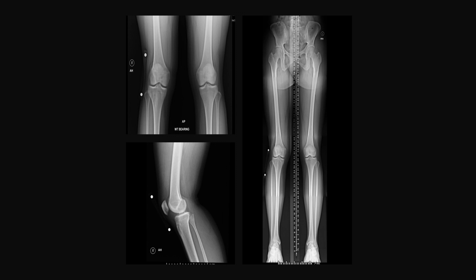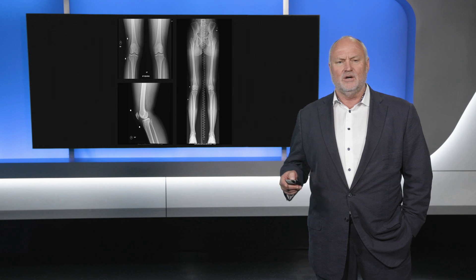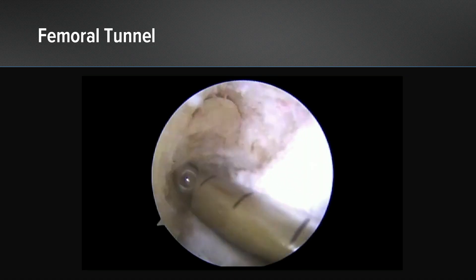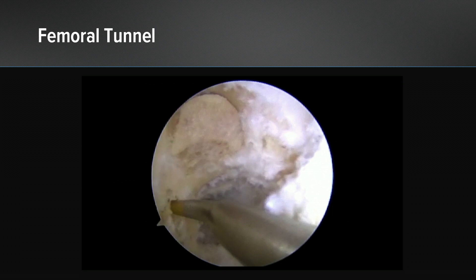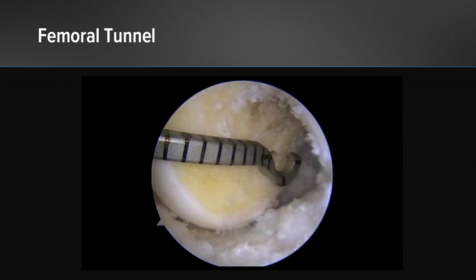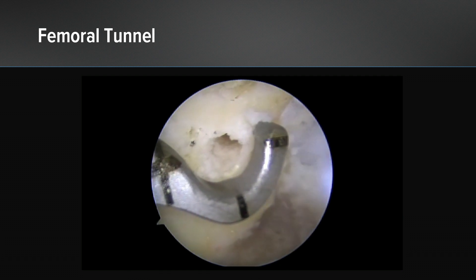Typical imaging in a revision setting for me is plain x-rays and long leg standing films where you can calculate an accurate slope. This video shows preparation of the femoral tunnel. You can see bone grafting of the old very vertical tunnel, and up above it using an awl to establish the location for the new femoral tunnel, not close to the old one obviously.